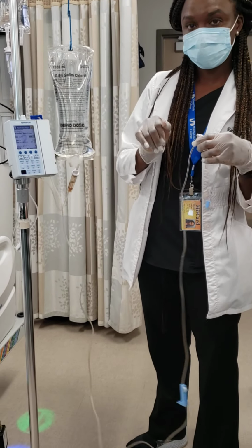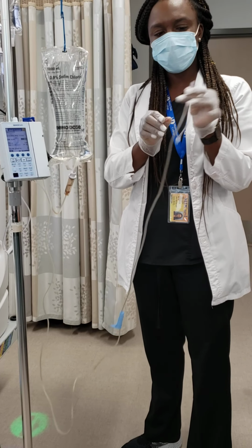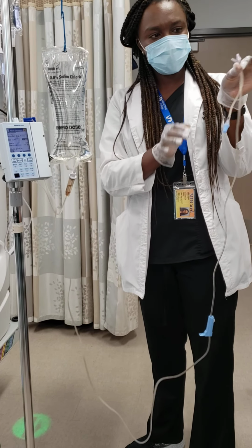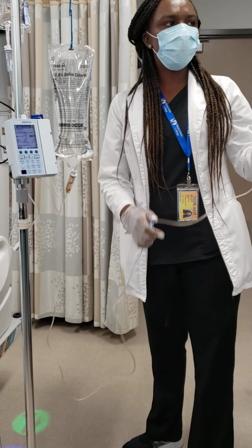You just stop it. Or I know what you're saying. You can clamp it like this, and then you push. I know there's a line, there's air in there, but you clamp it like this so it doesn't go back up the line. Yeah, you can do that.